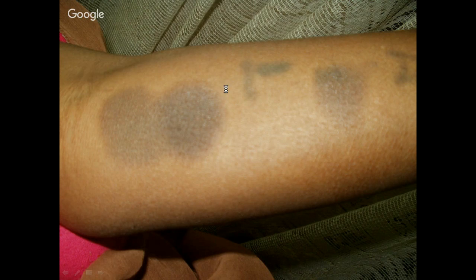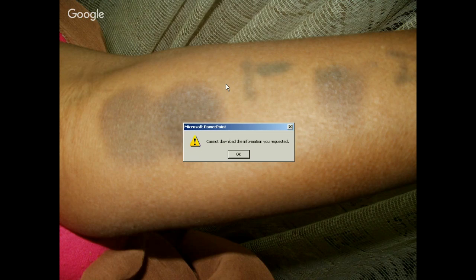What about Staphylococcal scalded skin syndrome? We'll come to that when we come to the vesicular-bullous. So in the next reaction pattern, I'll show you a case of Staphylococcal scalded skin syndrome. So remember, there is no necrosis in Staphylococcal scalded skin syndrome. The reaction pattern of Staphylococcal scalded skin syndrome is a vesicular-bullous disorder. So this also looks like a vesicular-bullous disorder because the skin is sloughed off actually, but this is not a typical vesicular-bullous disorder. So when we come to the Staphylococcal scalded skin syndrome, we'll go back to the slide and compare them side by side.